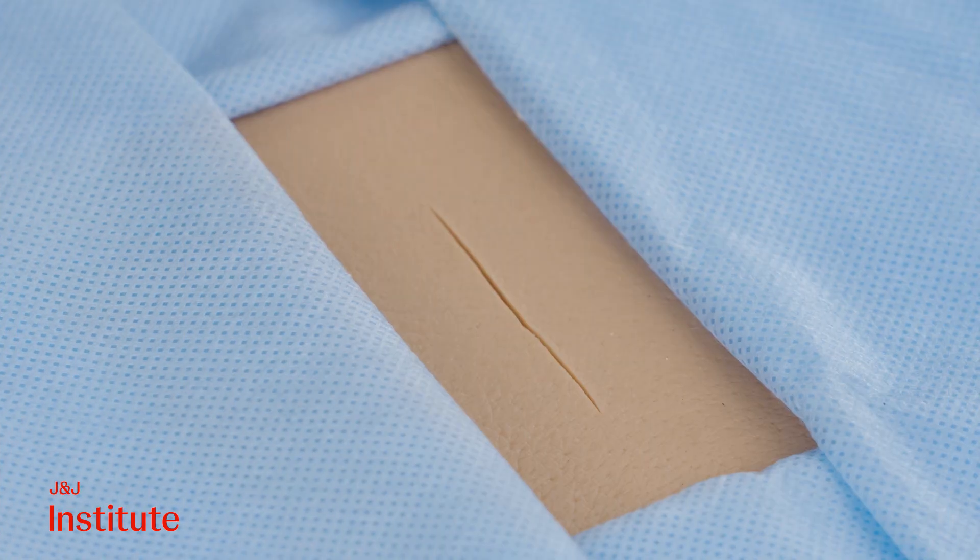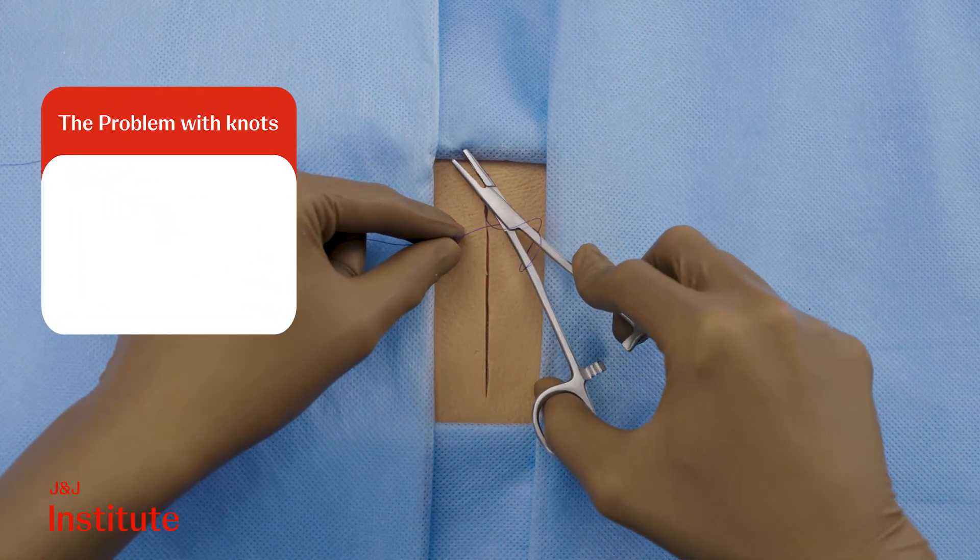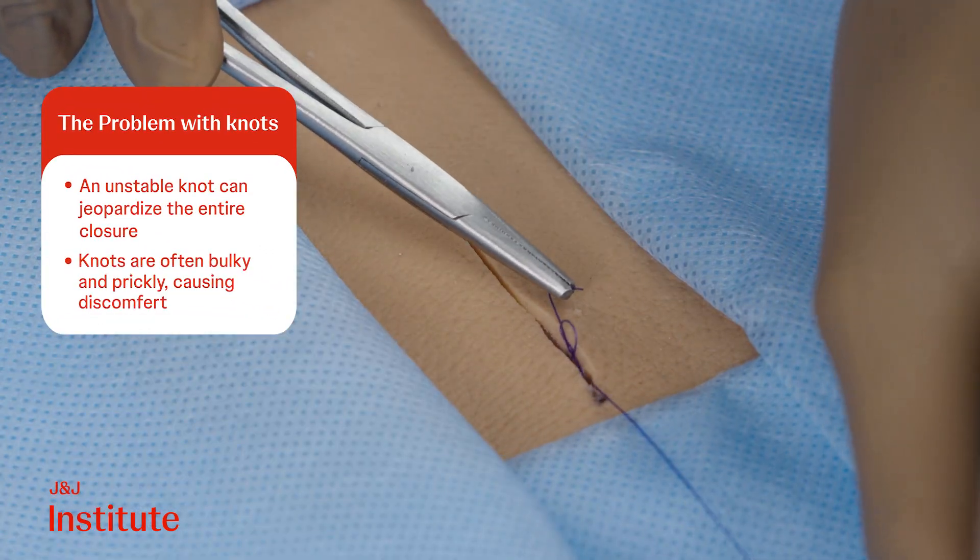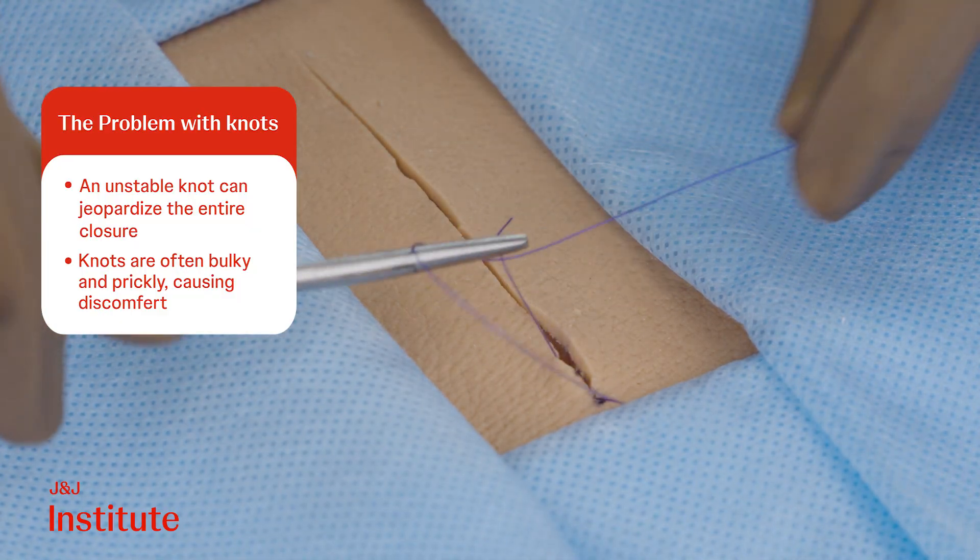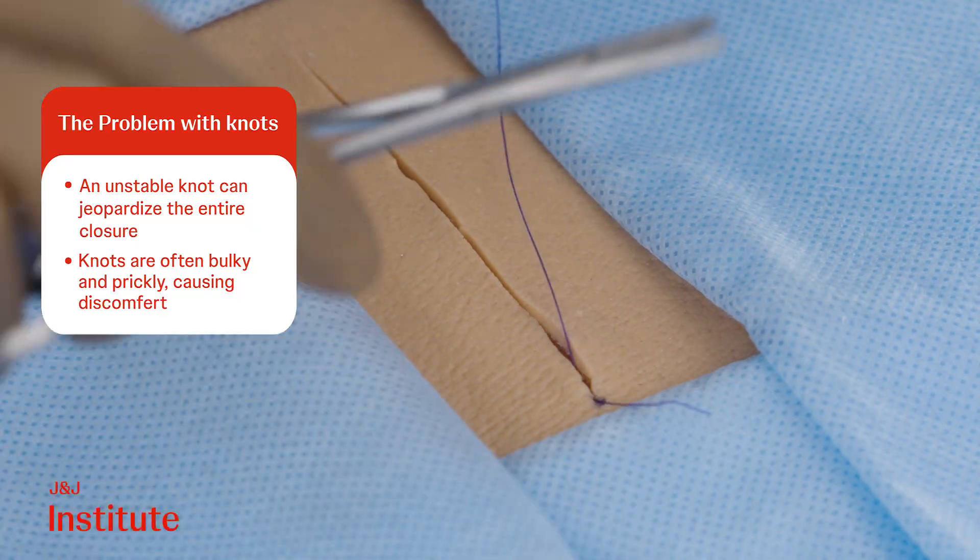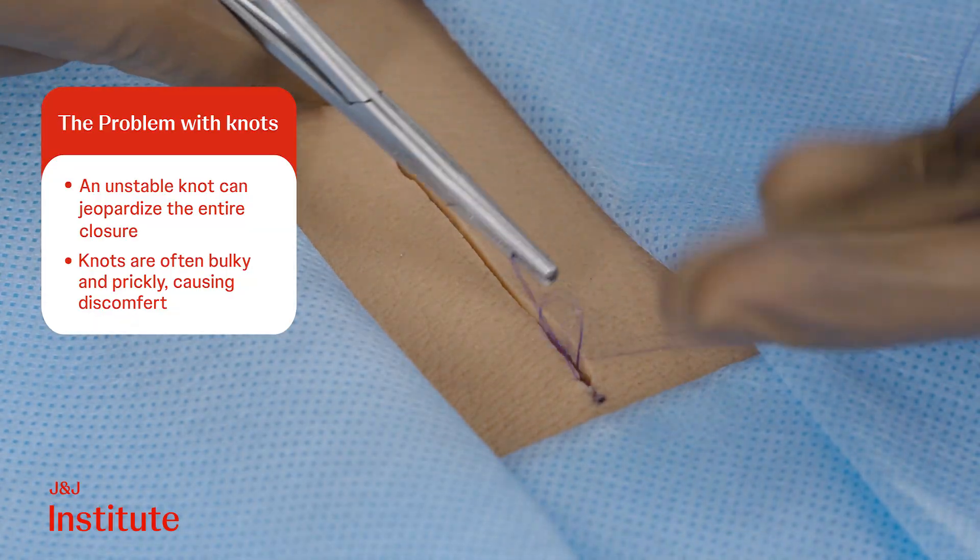While subcuticular closure yields impressive cosmetic outcomes, it presents its own set of challenges. One such challenge is its reliance on one or two knots for the entire closure. If these knots are improperly tight or if the sutures are trimmed too closely, there's a risk of unraveling.